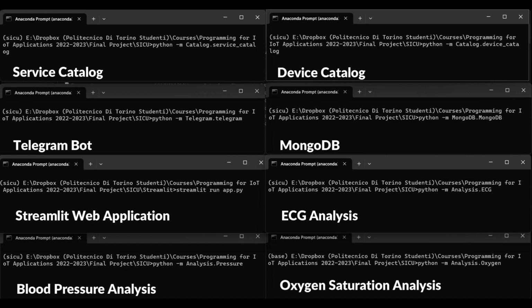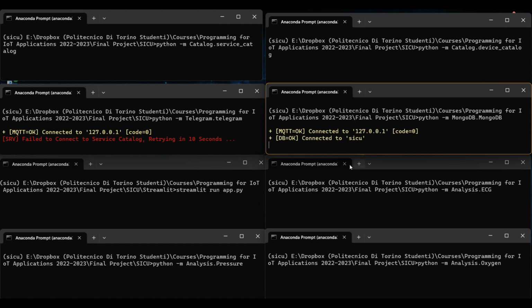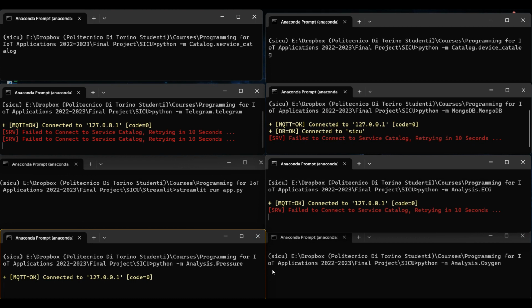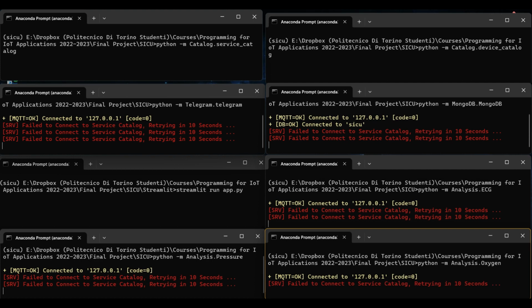But overall, I suggest you first run the service and device catalogs, then run the MongoDB database, and then you can freely run the different microservices in different orders. Here, as you can see, first I'm going to run the microservices without the service and device catalog, in order to see what happens if you do not run the service and device catalog first. As you can see, different microservices wait for the service and device catalog to be run, and then they register themselves, and then they can start working. First, they're going to communicate with different communication points and endpoints, and then they will stop working.